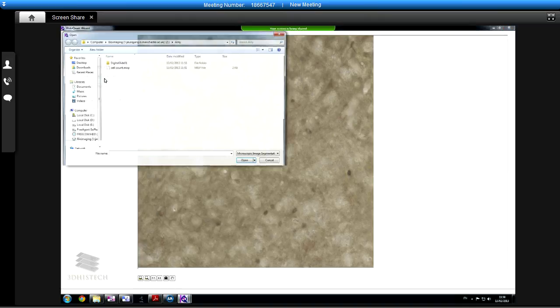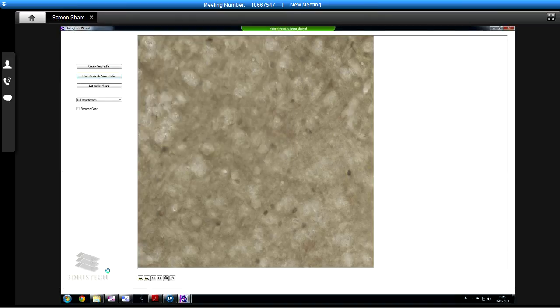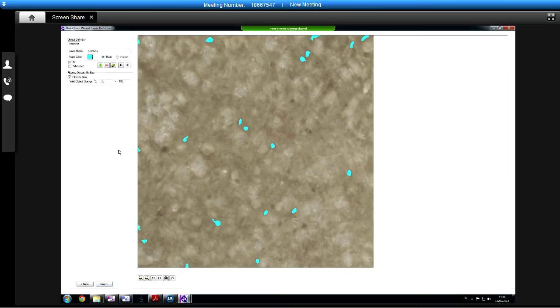So at the moment we're considering everything between 35 and 100. So let's change that to actually 35 and say there was something like 63, 60. So we show 70. Now that has taken out that one and that one. Would you consider those also positives? Right under the top one, positive. Okay. I'd say 6.